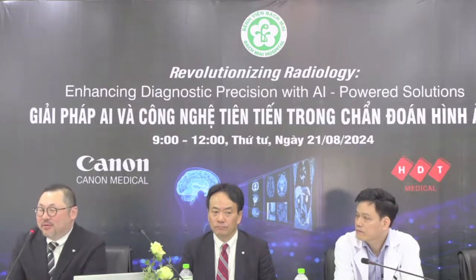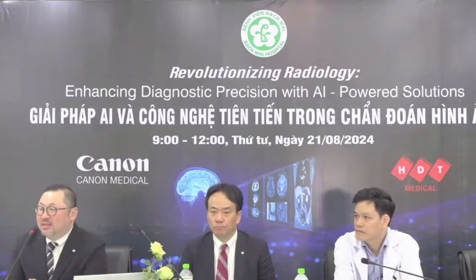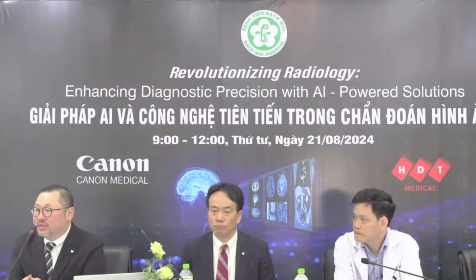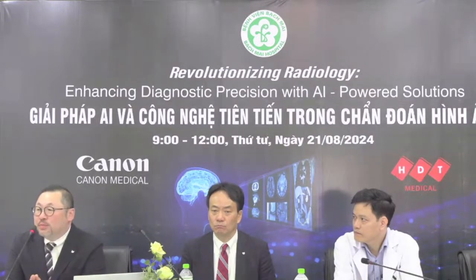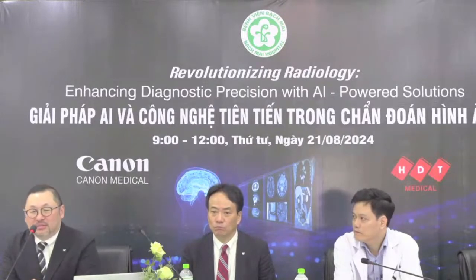Okay, to answer that question, I think this brings up one of the topics also brought up by Dr. John Ho, because the AI algorithm is only factory trained with the data that we have. So when it's applied on site at the hospital, it does not train anymore. The reason is we need to control the training, because some data might affect the algorithms. And for all FDA approved AI, there has to be a supervisor for changing the algorithm. Maybe Dr. John Ho has something to add on that.